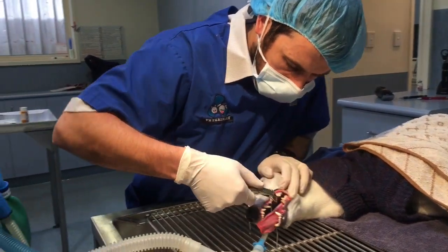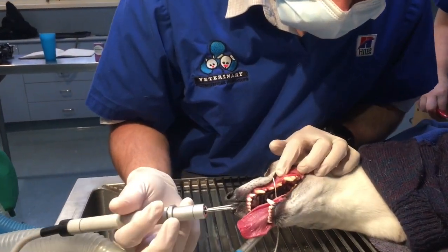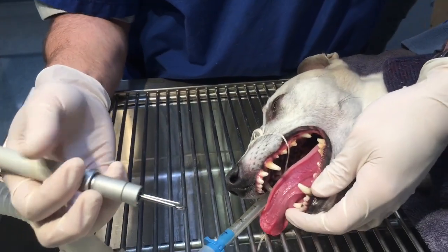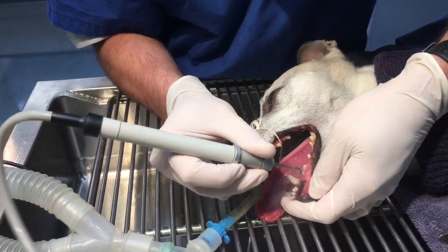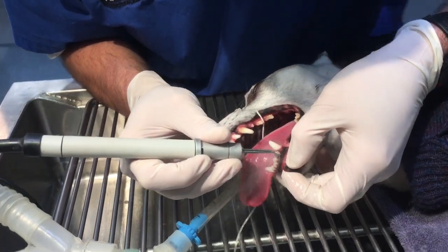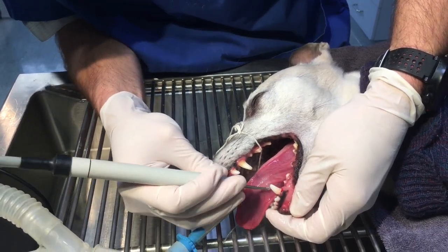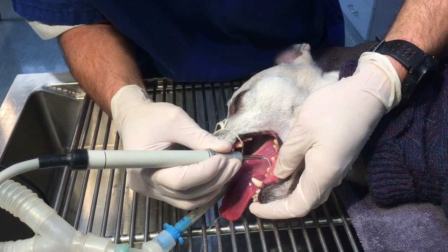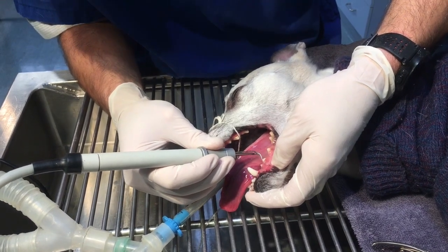That beeping is what's called the apnoea alert — that's the thing we use to check their breathing. I've chipped off most of the tartar. You can see under there the tooth looks pretty good. We use our ultrasonic scaler to come in and scale off all that tartar, check it down under the gums as well, and try and do every surface of every tooth. You can see there's a little bit of flattening of this tooth here — Rosie's a chronic ball chaser.